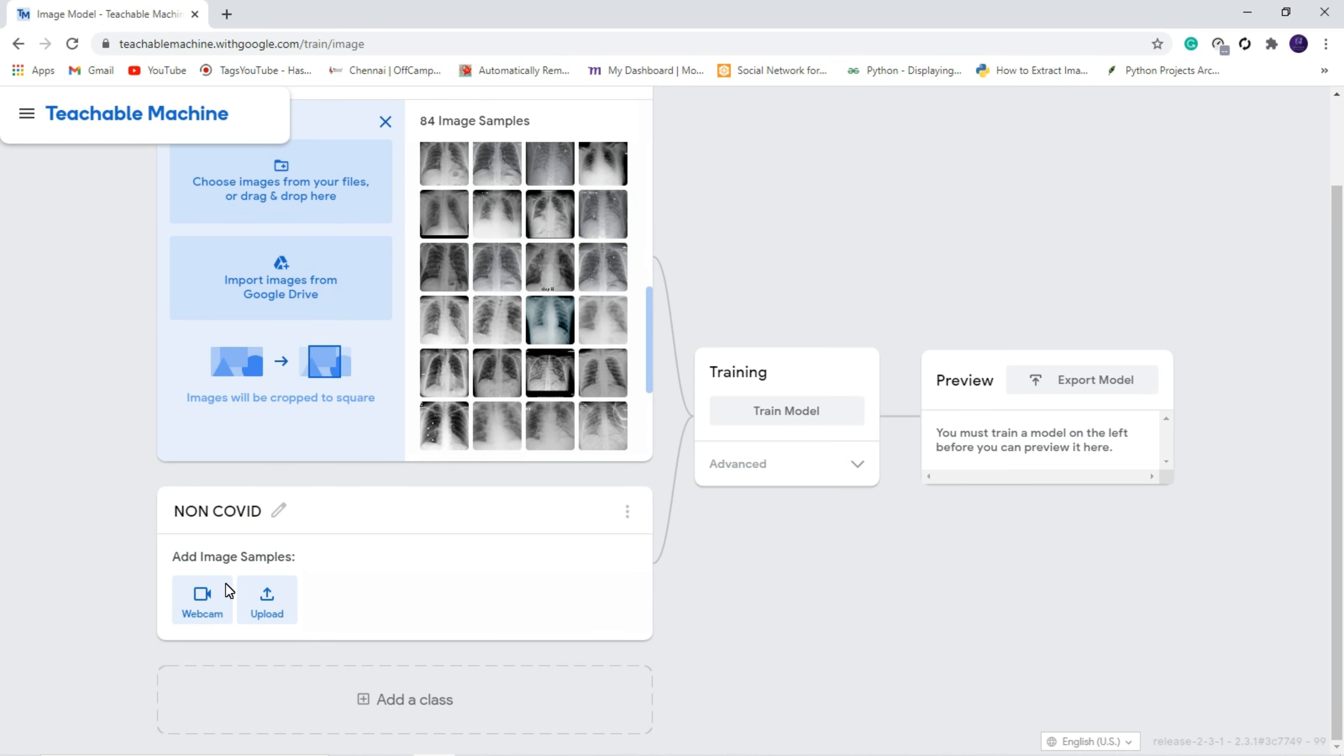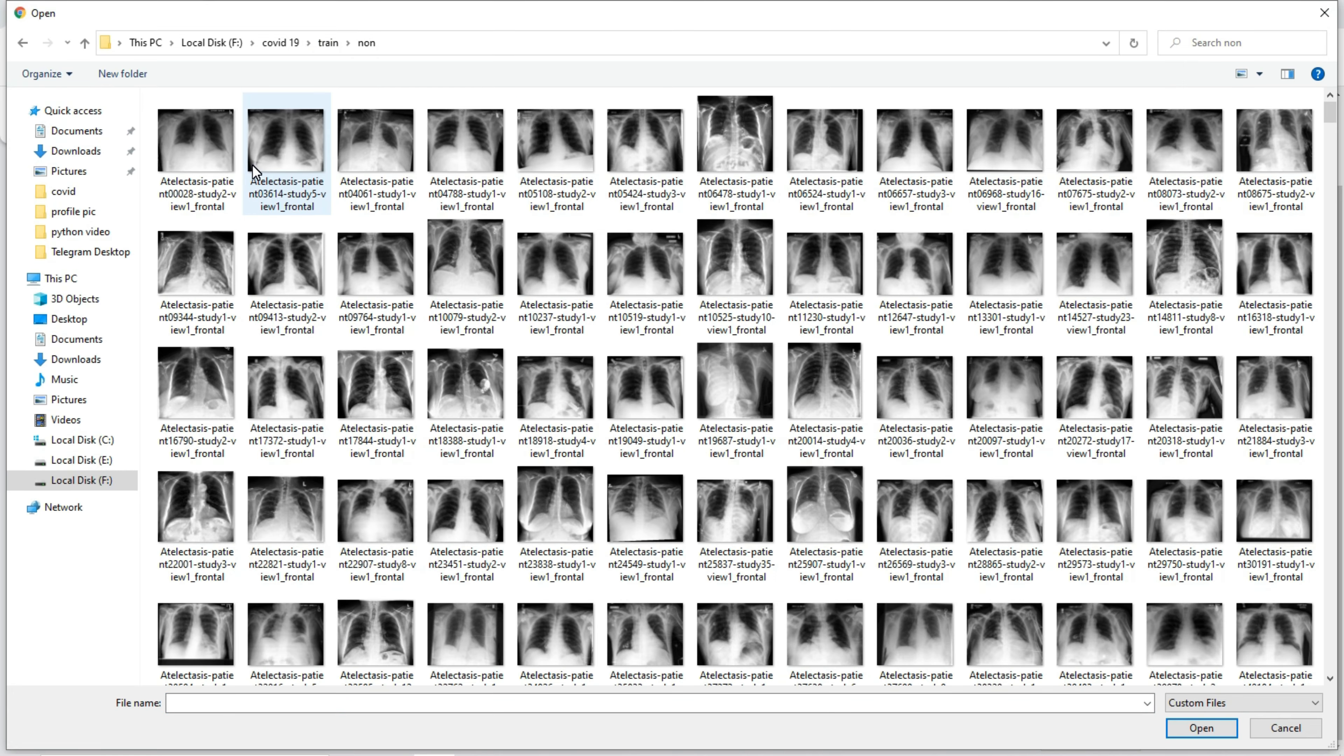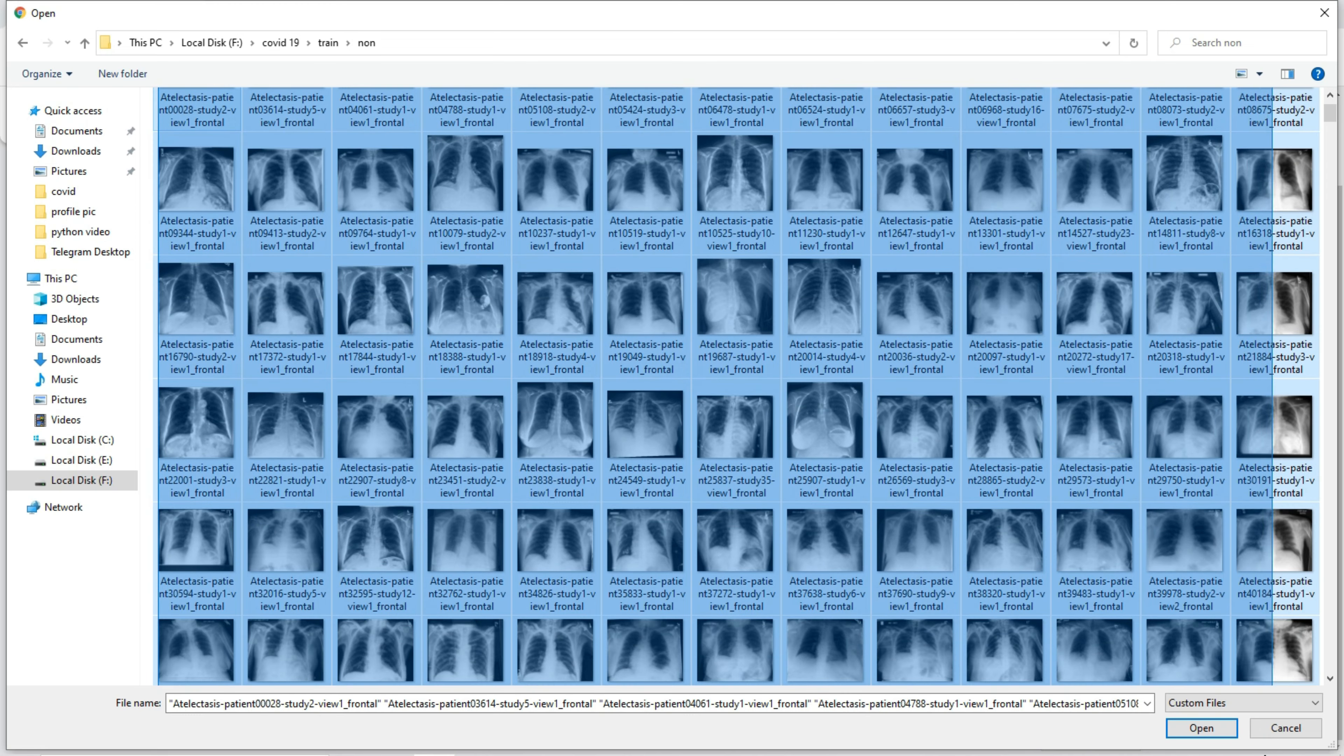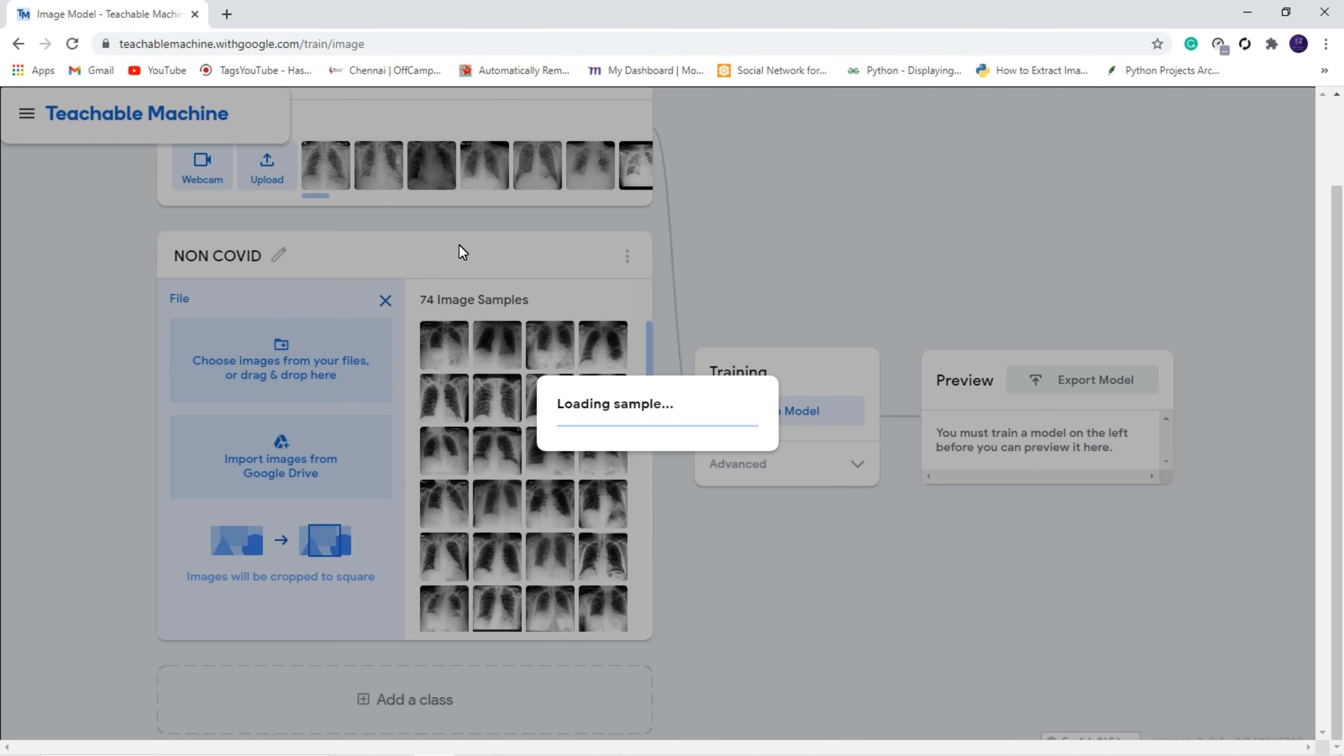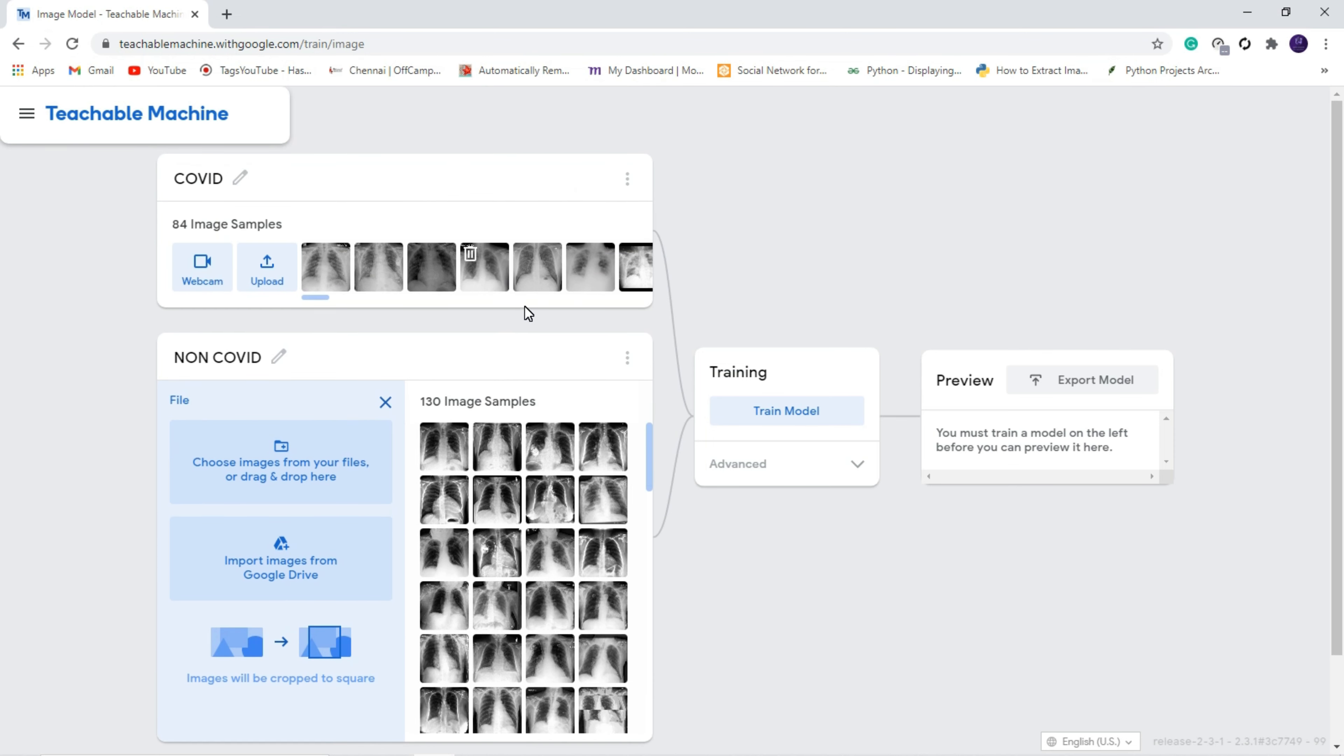We uploaded 84 images, and for non-COVID also we are going to upload more images. We uploaded 130 images. If you are having more images, you can upload it because the increasing image will increase the accuracy. That is why now I am going to train our model.